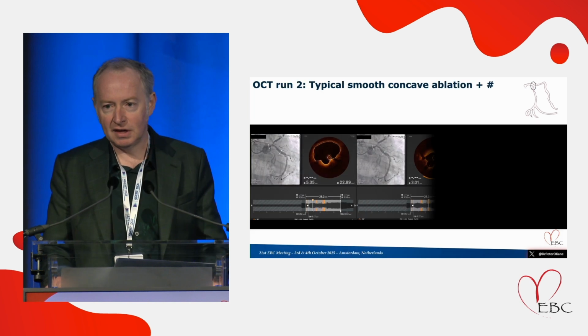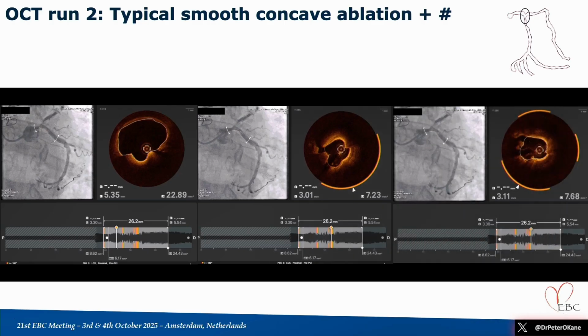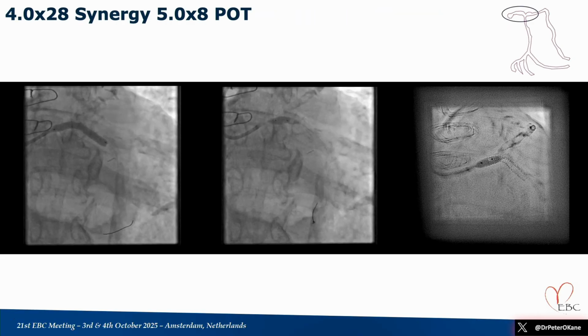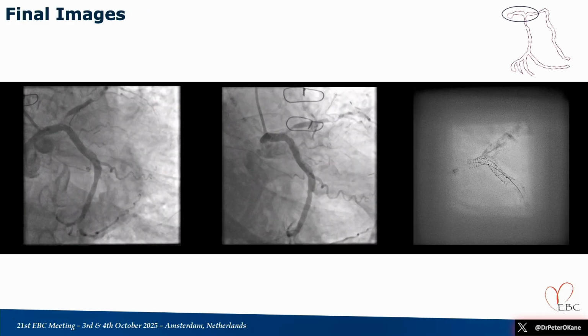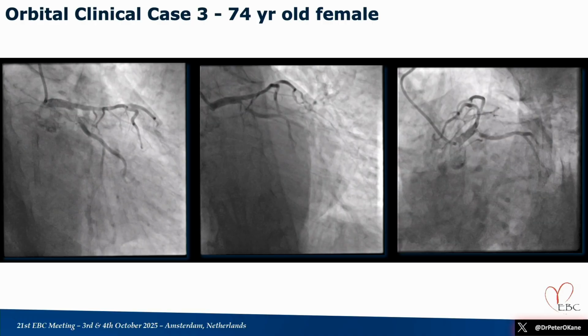And you can see on OCT, it's pretty clear. We've got good luminal gain. We've got some disruption, maybe some fractures there. And I think we're all good to go and put a stent in, and we put a Synergy stent in, a 5.0. In fact, I haven't shown you, but there's another OCT run where there's an edge dissection distally and we had to cover that. Quite a nice OCT with a bit of hematoma, but the second stent looks good.